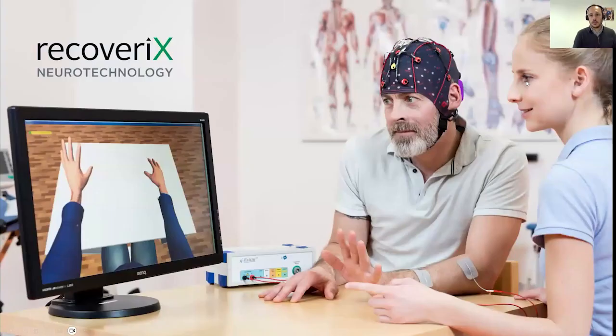Okay, this is the recoveriX system. I'm sure Christoph explained it before, but I want to remind you a bit. First of all, this is a marketing picture, so it doesn't show all the components. We have an EEG cap, the patient, and the therapist next to the patient. The patient is using this EEG cap. It is not the real one, because we have 16 electrodes over the motor cortex.